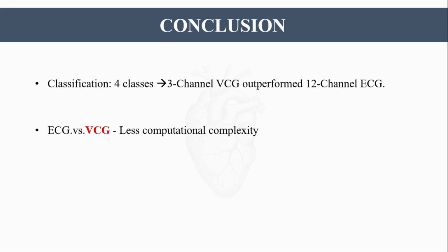Moreover, VCG has offered less computational complexity as compared to ECG, as it has fewer channels. Our future strategy for this work is to expand the number of classes of cardiac disorders along with balanced datasets.